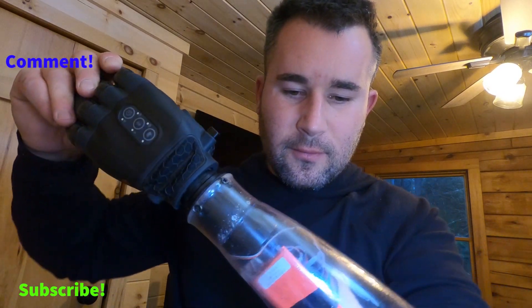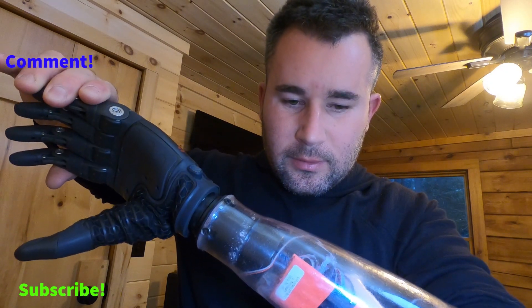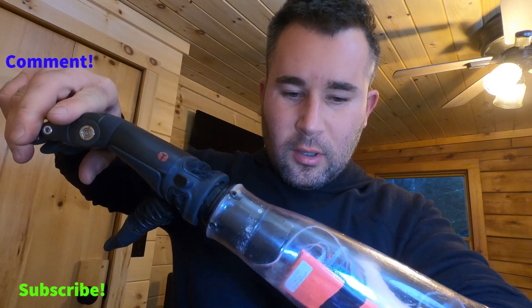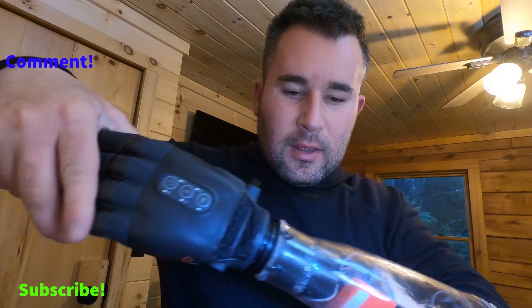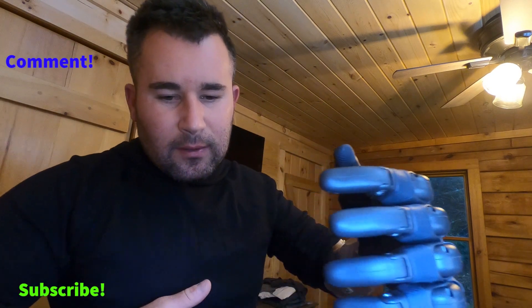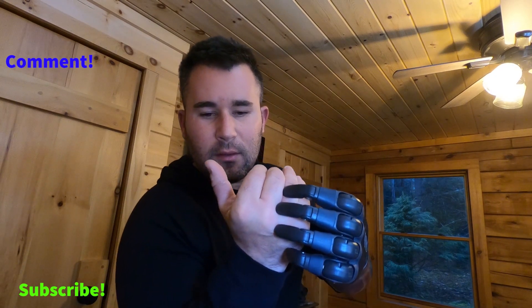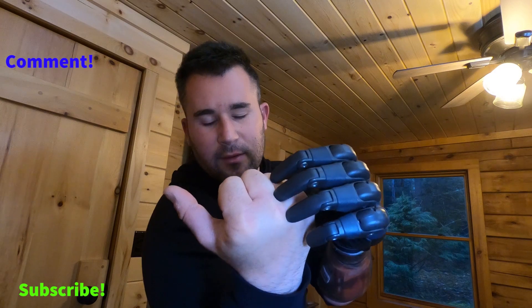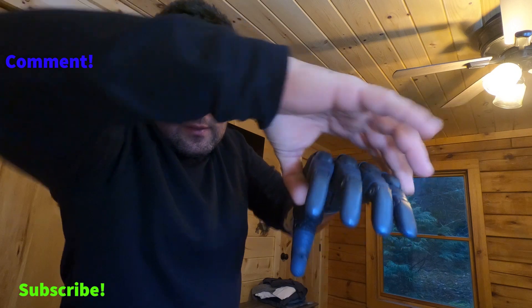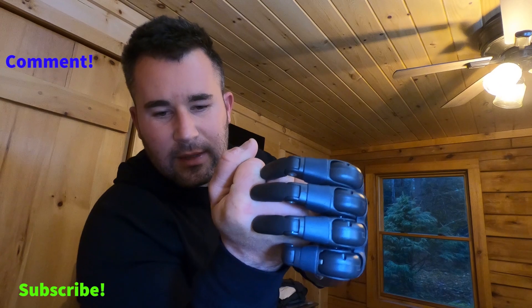Why I don't like the way this rotates is because it's too easy — it rotates manually way too easy. It's hard to describe, but think about it this way: if you put something heavy in this hand and you're holding it like this, there's pressure that wants to pull down on the fingers and rotate it.